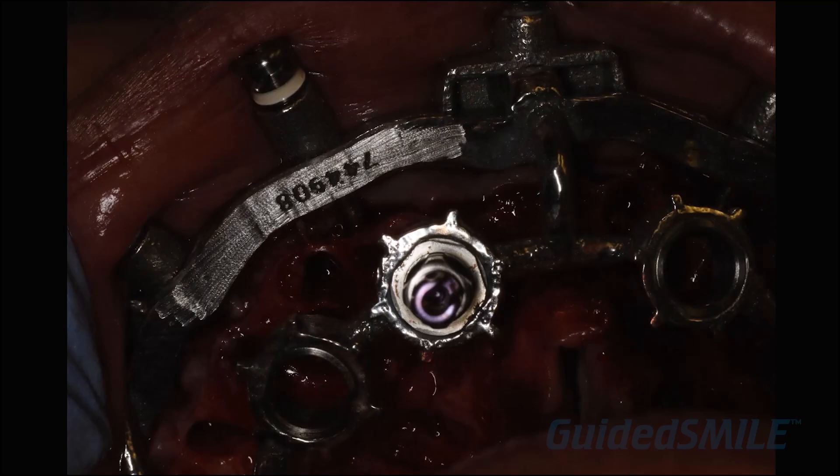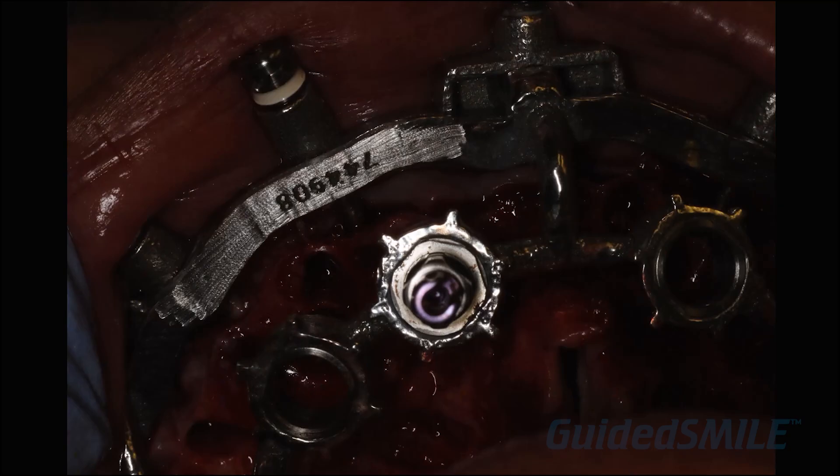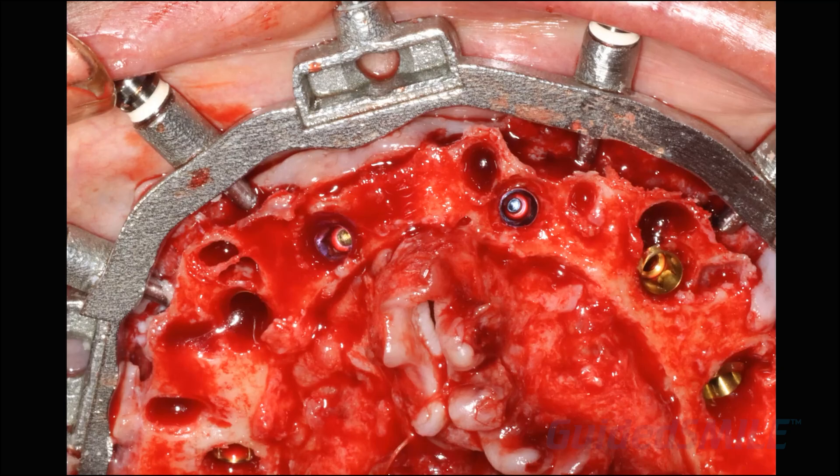On this site, you can see the dot is lined up really well with the hex. But in this image here, it might be off just a little bit — this temp cylinder coming off here is a little bit out of rotation, and maybe this one here is a little bit out of rotation too. We'll cover that in just a minute.